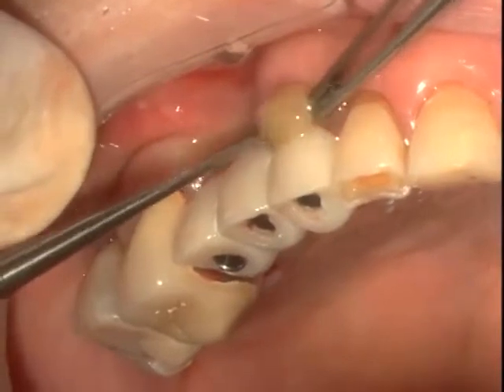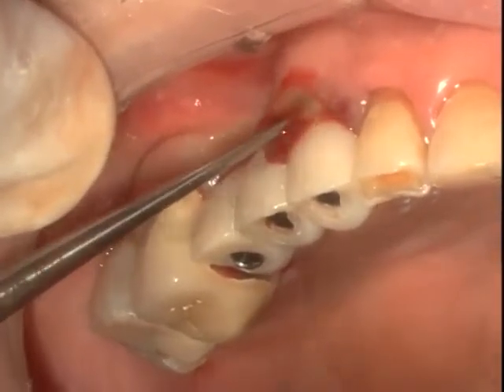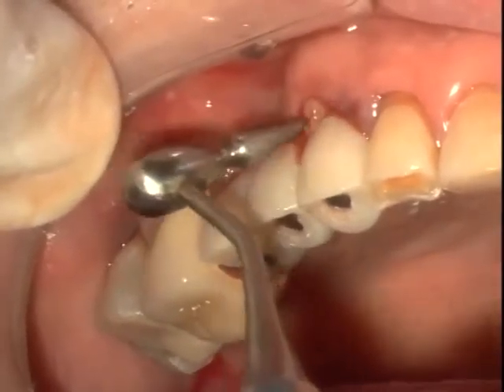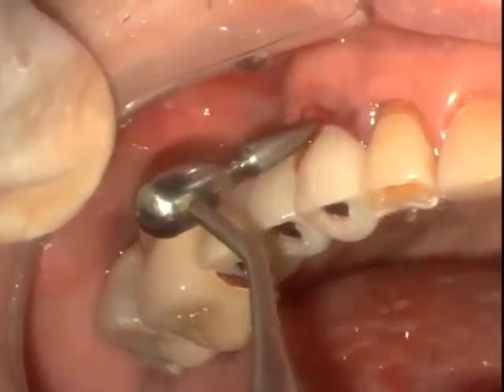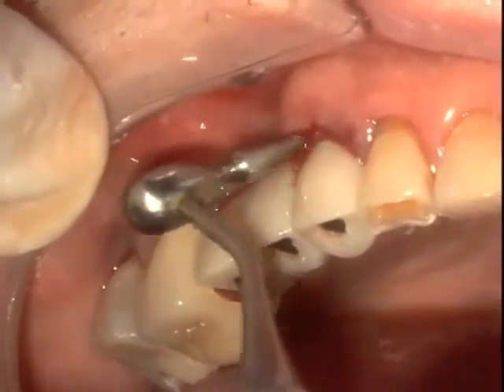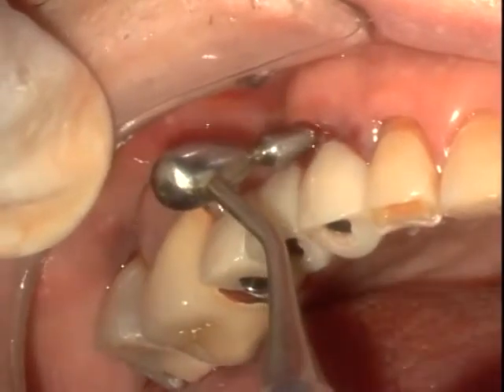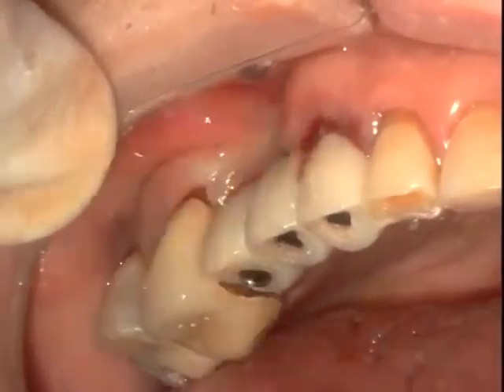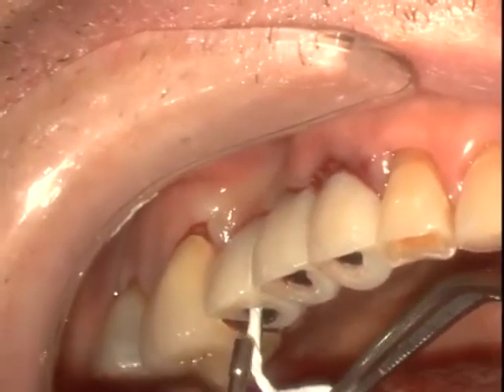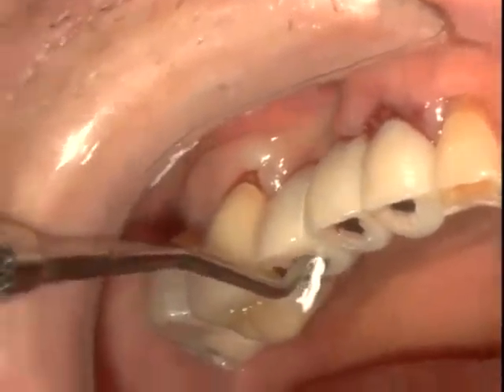The final PRGF fibrin being placed after screwing in the temporary restoration the day of surgery. You can see just packing that in with the bird beak bone instrument, lightly packing that in just to seal off the bone graft that is beneath this facial plate on the extraction site area, on the area of the canine. Packing in Teflon into the screw access channels.